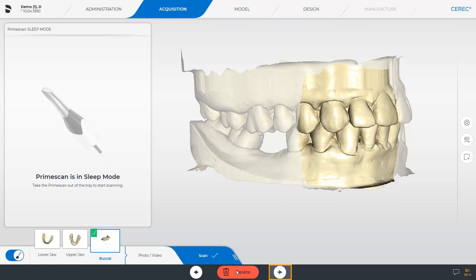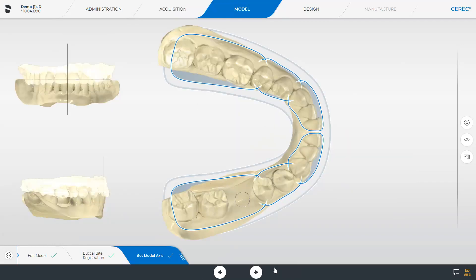We move on to the next phase: the model phase. In this phase, we are directed to the Set Modal Axis step. The CEREC software performs this step automatically and is intended for verification. If needed, you can correct the three views, or as in our case, switch to the next phase: the design phase.